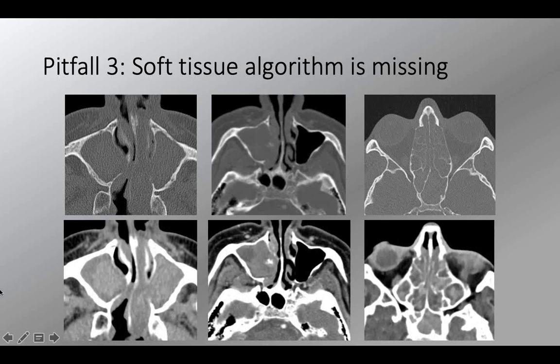So in this case, you see that you have high attenuation centrally in the maxillary sinuses. So this is equal to a pyocele. This was a patient with cystic fibrosis, sclerotic bone, chronic infection. We see demineralization of the lateral nasal wall. This is not destruction. And if you look carefully, you also see that something is coming out from the maxillary sinuses. So this is an antrochoanal polyp in addition to bilateral pyocele.